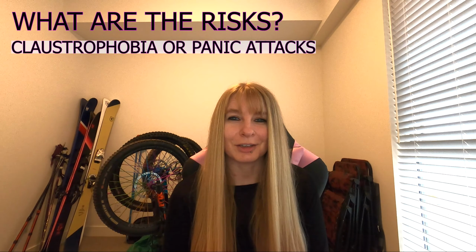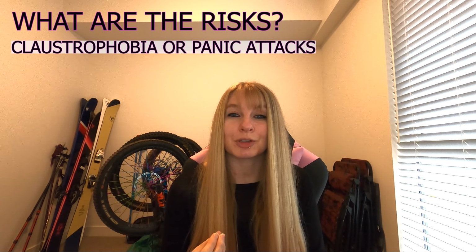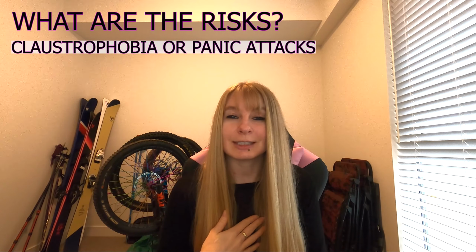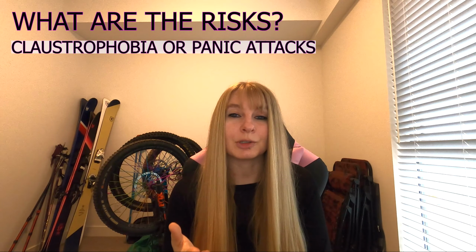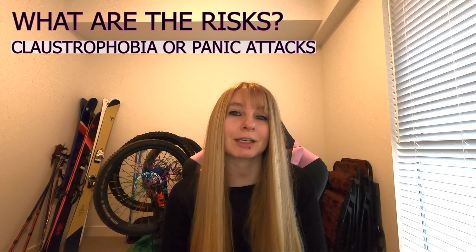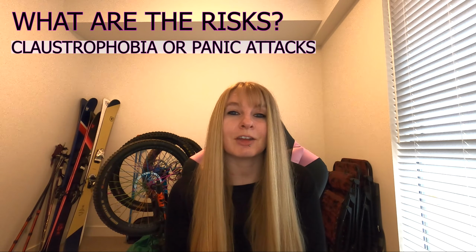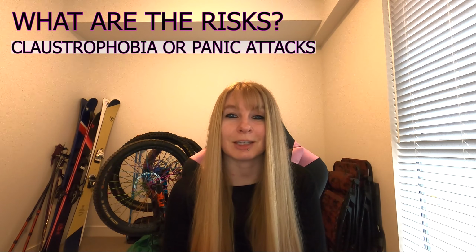Just as a last side note, I spoke about claustrophobia in my last video because you're in very close proximity to quite a large machine. Although I don't find the CT as close quarters as the VQ, if you are someone who is prone to panicking or does suffer from claustrophobia, then make sure the technician knows beforehand to try and make the process go smoothly. Generally, they've been given a lot of techniques that they can use to talk you through the process and keep you calm.